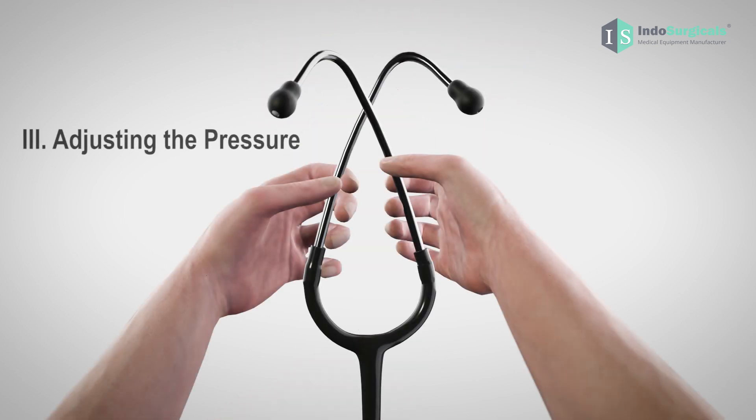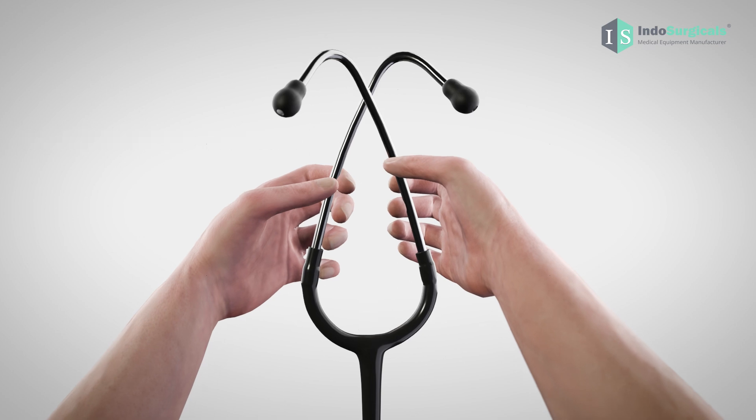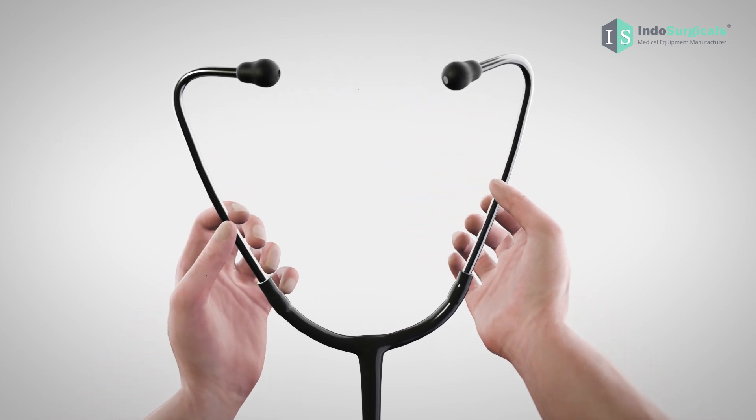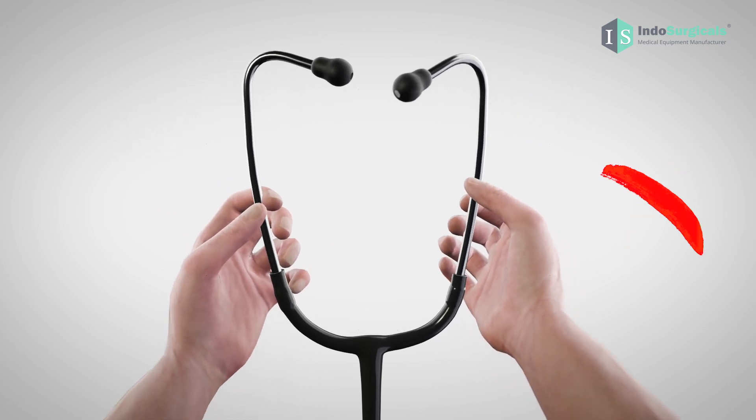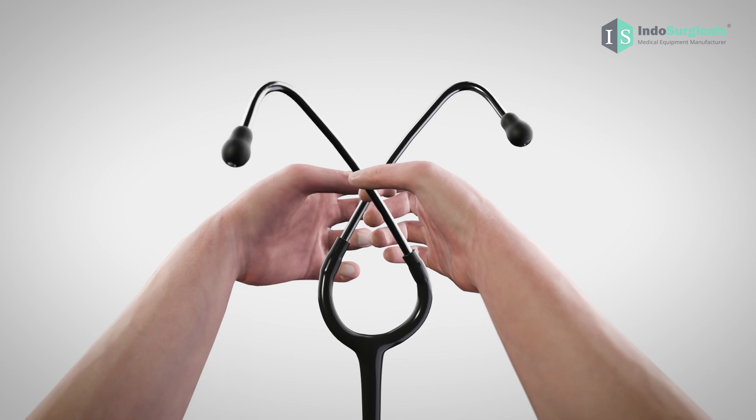To reduce pressure on your ears, gently pull the binaural tube outward. Avoid exerting excessive force to prevent any damage. If you feel it is loose, just pull the binaural tubes inwards.